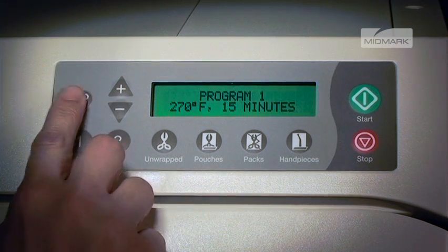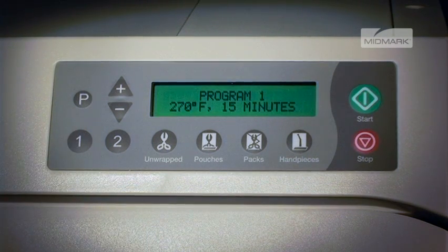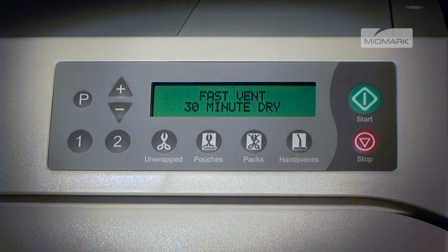Now, if you select the 1 button, the display will show the new parameters. These parameters will remain in memory until they are changed, and will remain even if the sterilizer has the power turned off by unplugging.